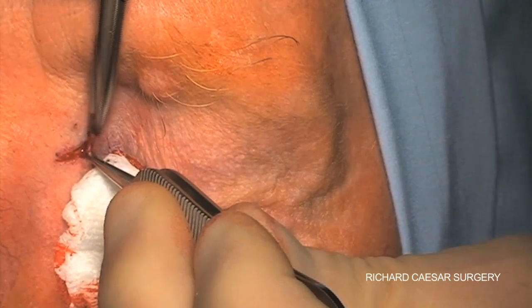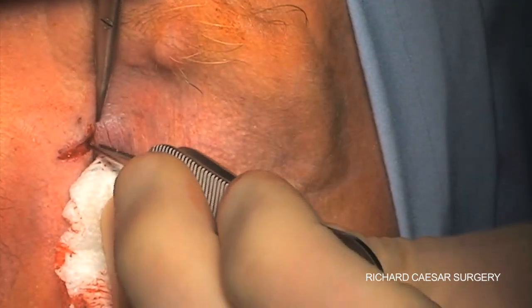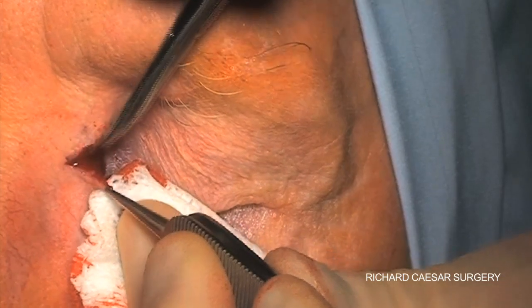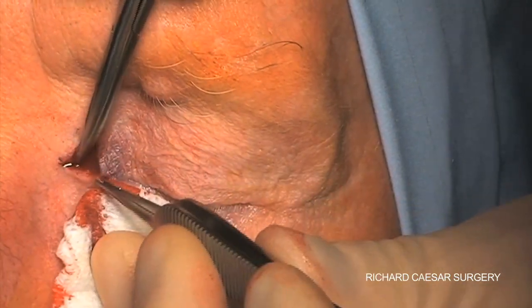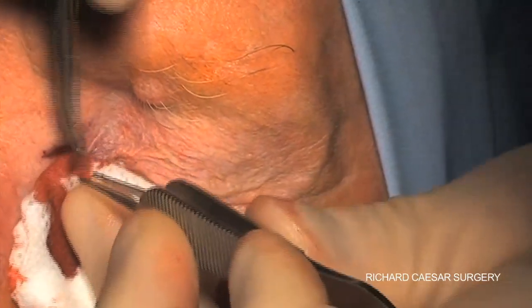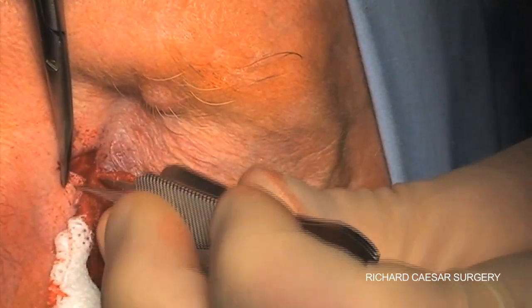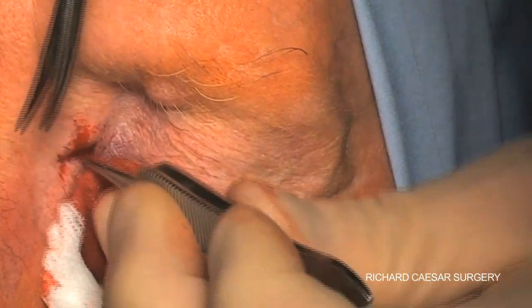Spring scissors then open up the small flaps. This inevitably produces a little bit more bleeding. You can generally continue if your gauze can control the bleeding, but if the bleeding is compromising your view it's always better to stop and cauterise.